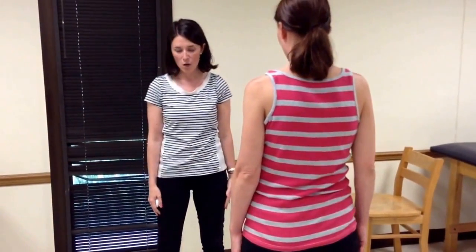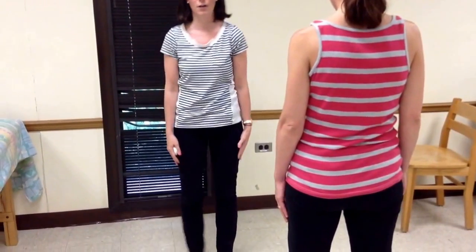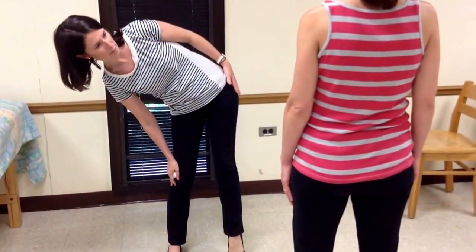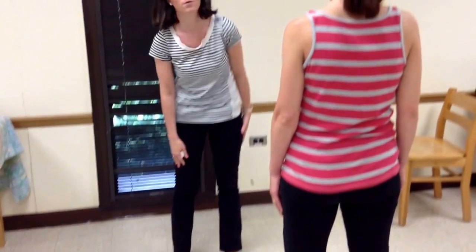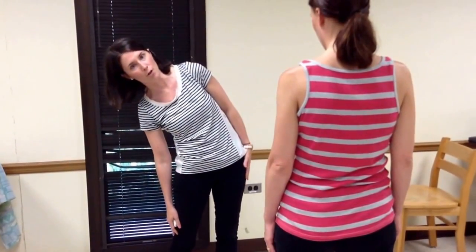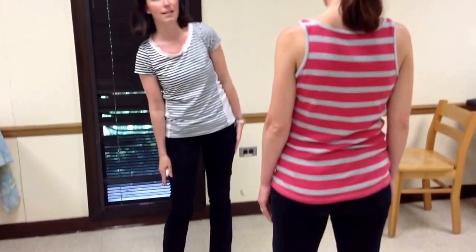There are a couple of things we don't want to see. We don't want to see the person lifting up the contralateral foot. We don't want to see them coming forward into too much flexion. We want purely a frontal plane motion, and we also don't want to see too much bending of the ear. Those are the compensatory motions that we're looking for.